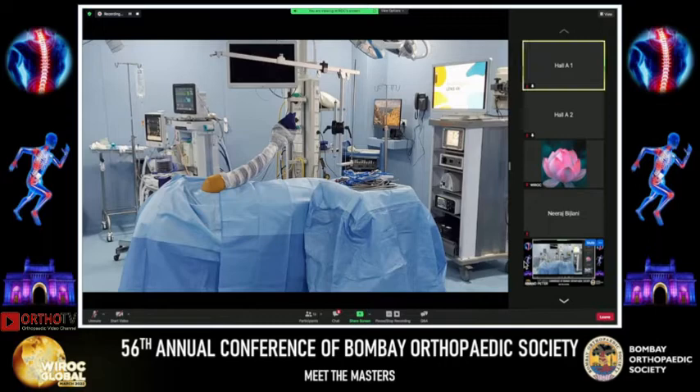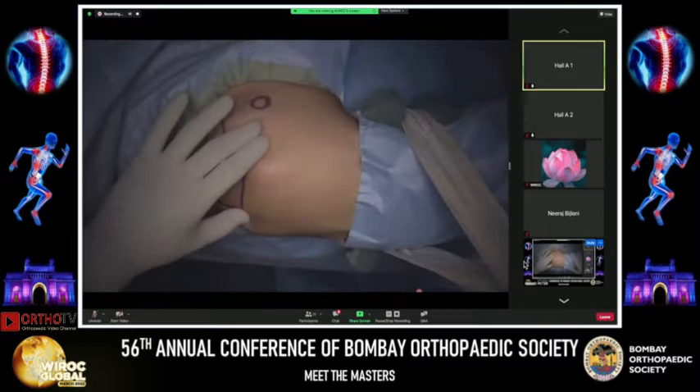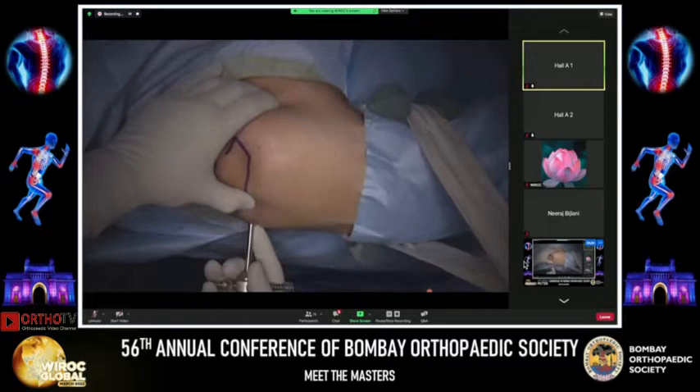The patient is being operated upon in the lateral position. This is anterior, this is posterior superior, and that's the coracoid process that's been marked out. I start with a standard posterior portal for my visualization, taken at the soft spot, typically one thumb breadth medial and inferior to the posterolateral angle of the acromion.